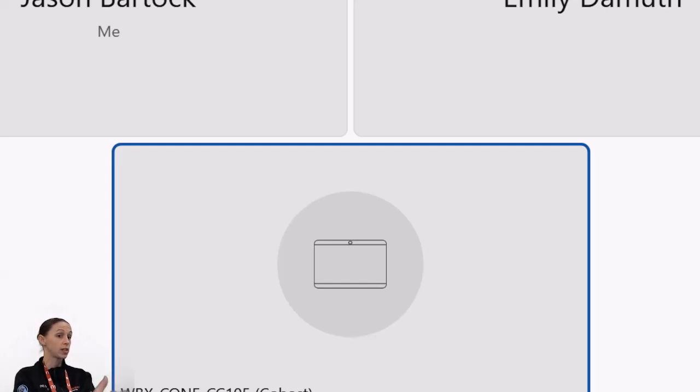And so that's where we have, in a couple scenarios, used VAV, where rather than just splitting that return, you're still draining from a vein, but you're returning part to the artery and part to the venous system. So you're both hemodynamically supporting the RV and lessening that afterload, because you're returning part of the flow to the arterial circulation. So it's a way to hemodynamically support the RV, which I think we've only done 2 or 3 times maybe. I don't know if you have more to say about VAV.